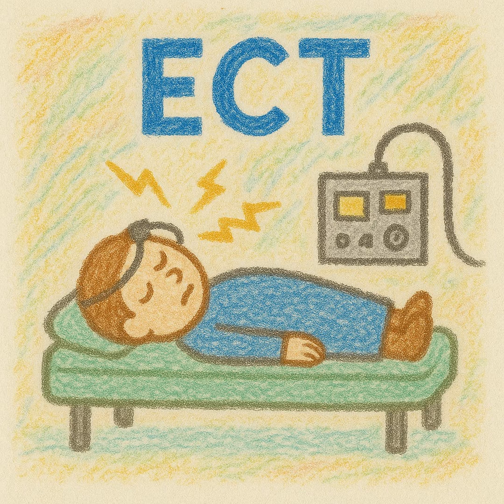And then I think from just a kind of safety standpoint, it's good to know that the motor seizure has ended, because if the motor seizure has ended, then most of the time they're going to come out of it. The seizure is going to have ended, and at the very least, they're going to be able to breathe. Their motor activity is not going to be convulsing. And that's the main thing. So the worst case scenario would be they kind of go into a non-convulsive status epilepticus, where they're altered, but they're still able to carry on their basic functions of breathing and things like that. So I think the cuff technique is important for that reason. And then you deflate the cuff after the seizure is over.